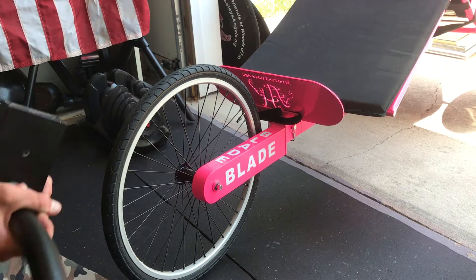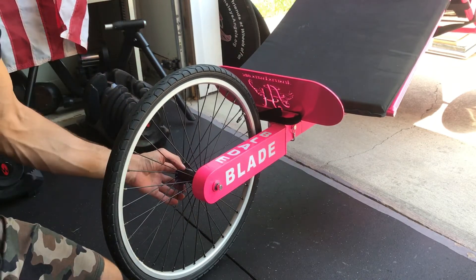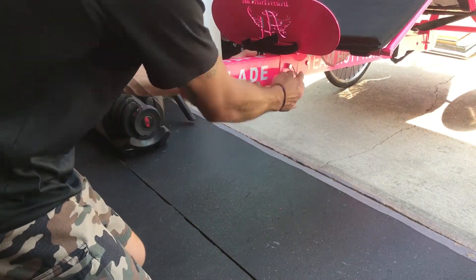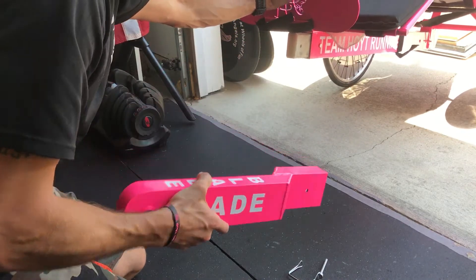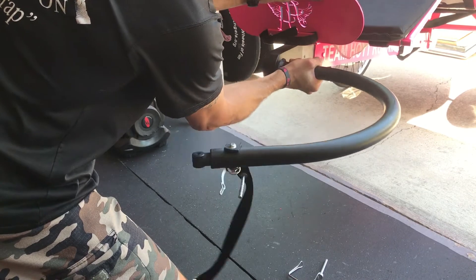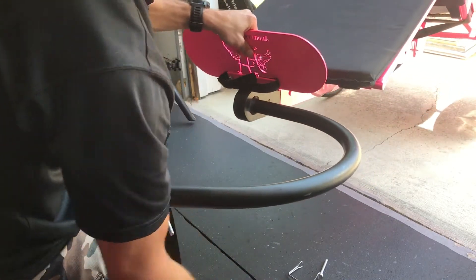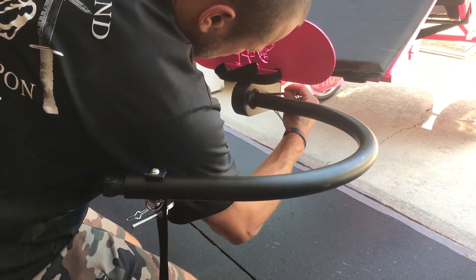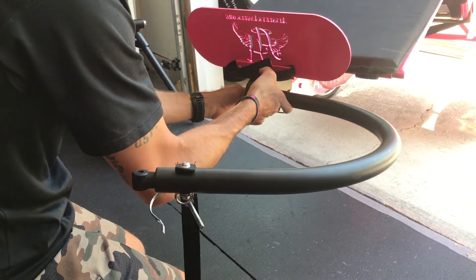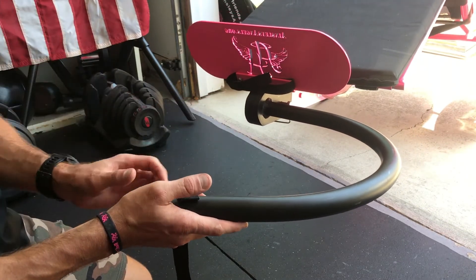Now we're going to talk about putting your Hoyt running chair bike boom onto your Hoyt Blade. The first step is removing the front wheel and setting that aside. Underneath there's a pin that you remove, and then the front fork will slide off. The bike boom then slides in, and the next step is inserting that pin back in — make sure the fork is fully seated and the pin is clipped on the other side to ensure it's fully attached.